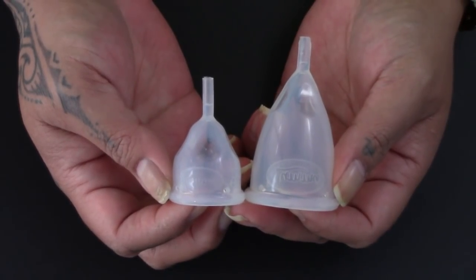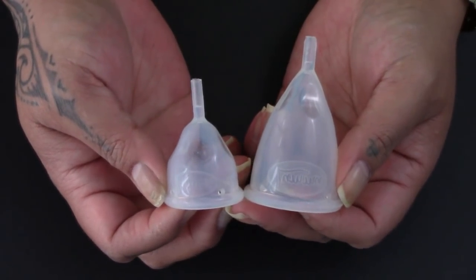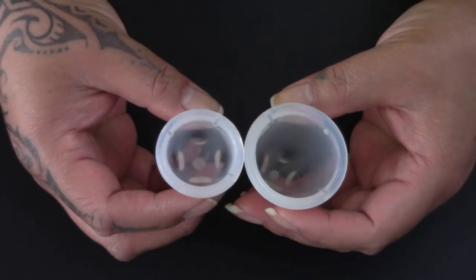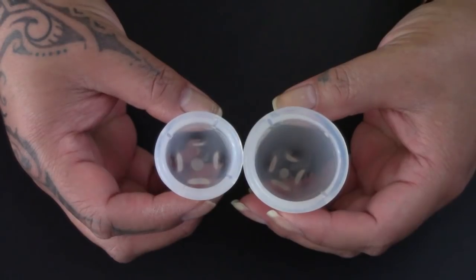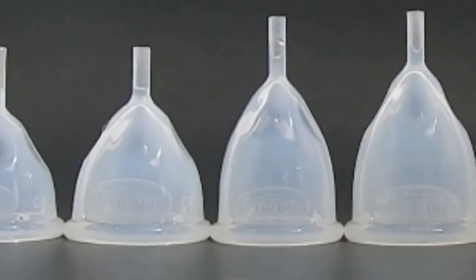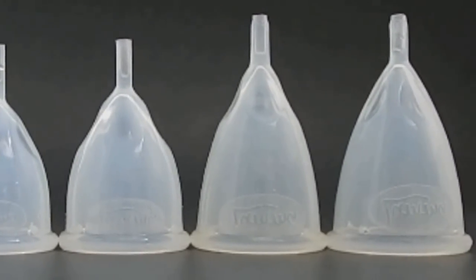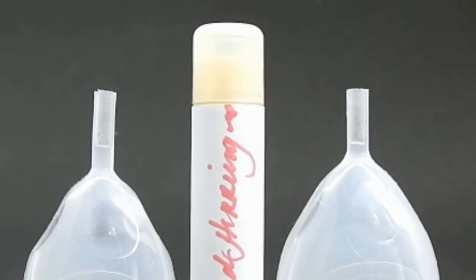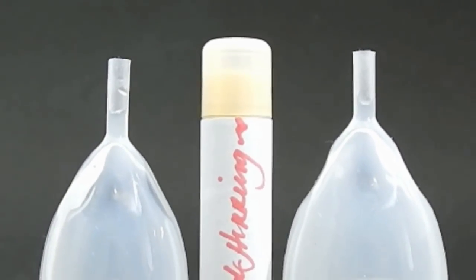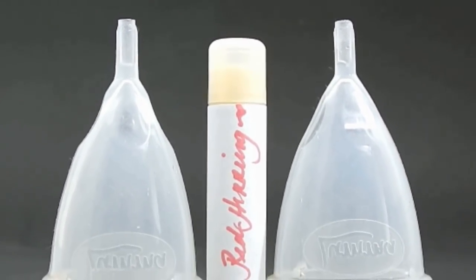I'm going to scroll past all six of the different sizes that the Luma cup has to offer, but I do want to show you the difference between the largest and the smallest cup they have. Here are the two different diameters of the largest and the smallest. So here are all six sizes of the Luma free cups and easy cups — the two for a low cervix, the two for a medium cervix, and the two for a high cervix.